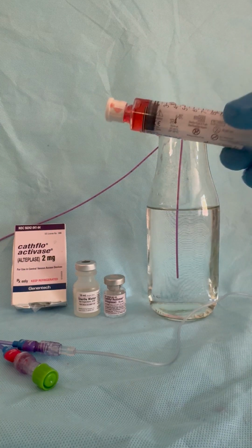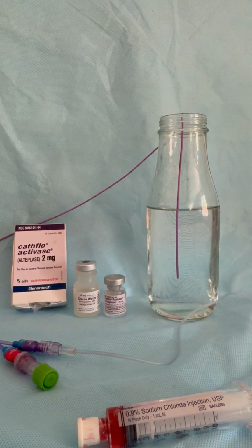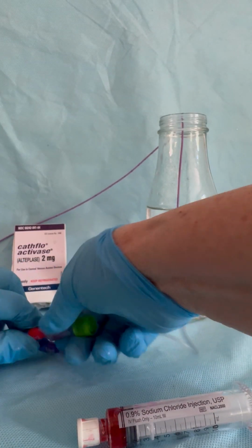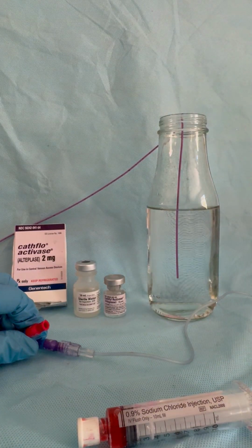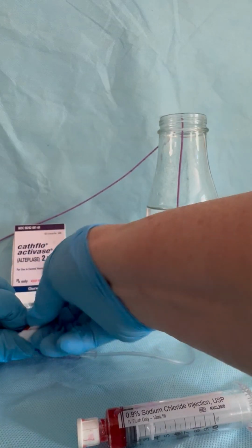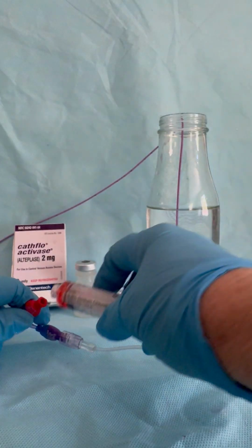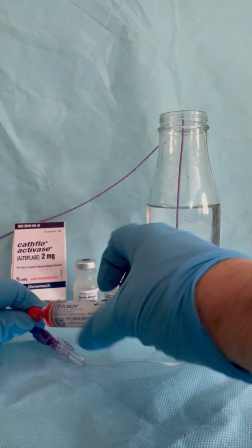Okay, so I'm going to show you this 1 milliliter. So let's pretend that with this patient's catheter, I'm able to flush it, but I cannot get a blood return. And so I'm going to clean here. And I've done all the things we've already talked about, probably moving the patient around, flushing, trying to get some blood return out of that catheter.